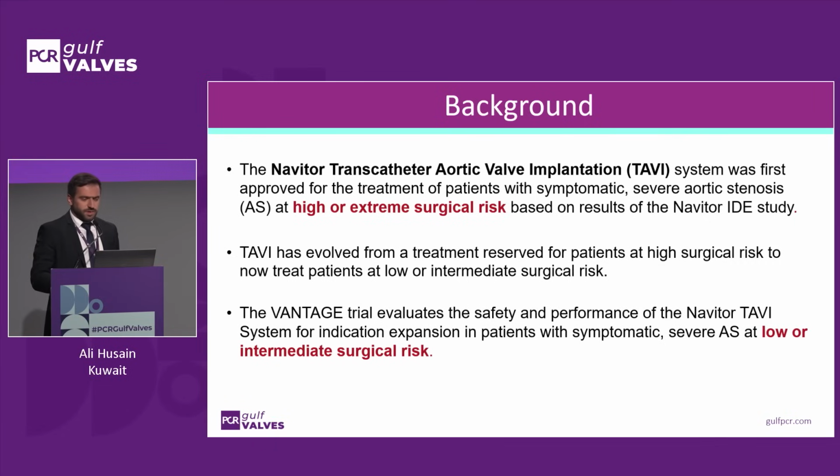So the Navitor TAVI system was first approved for the treatment of patients with severe symptomatic aortic stenosis who are at high or extreme surgical risk. And this is really based on the Navitor IDE study. But since then, the indication for TAVI has evolved and expanded.